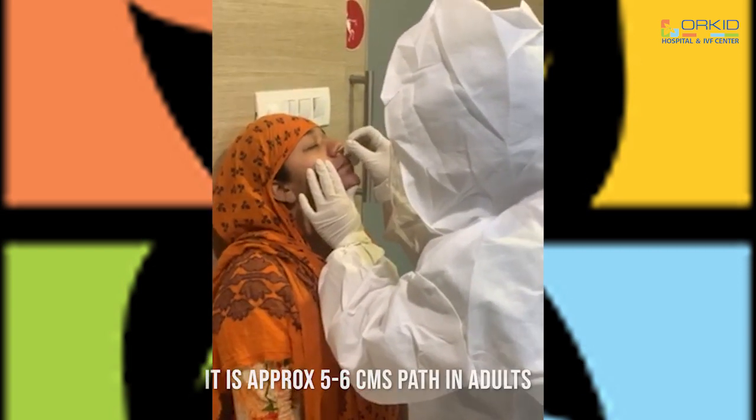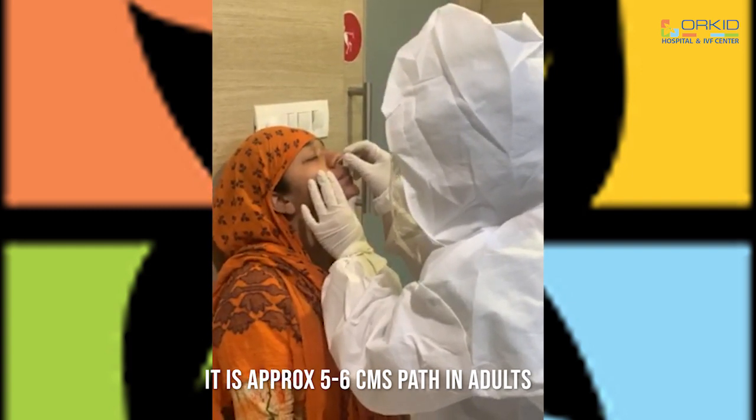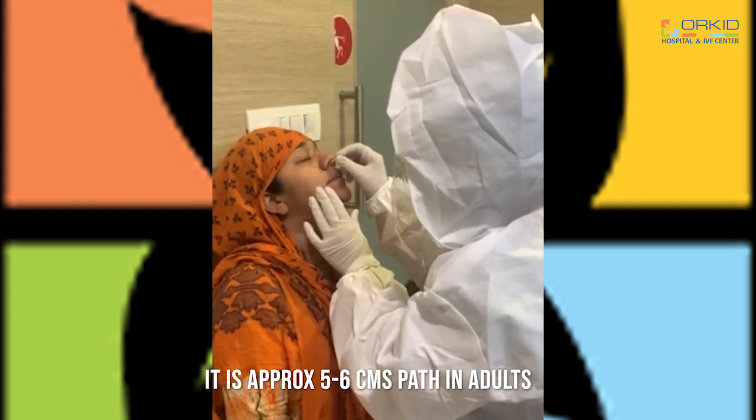Now I am rotating and twisting the swab stick, and then coming out slowly and gently.